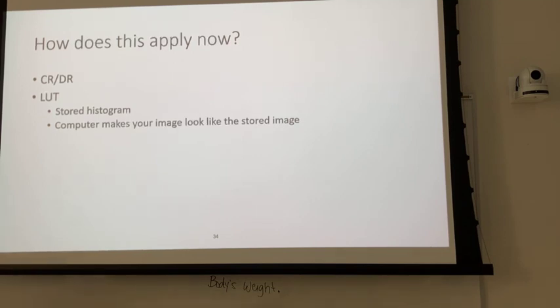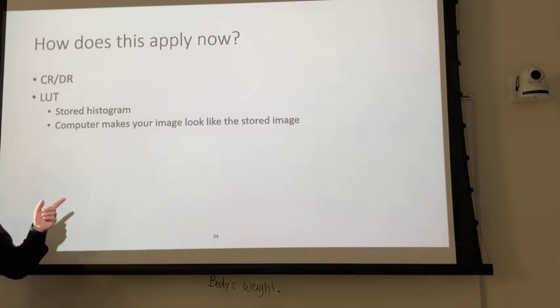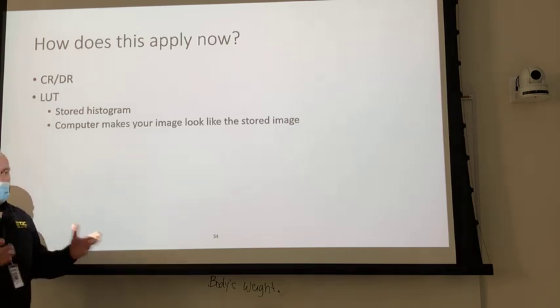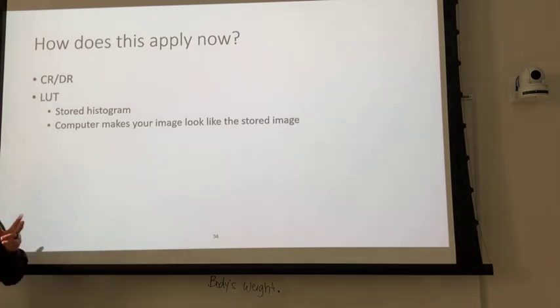Absolutely it is. It is absolutely a better system. It cut back on radiation exposure to the patient eventually. Whenever we talked about screen speeds before, whenever we went to CR, the dose went up to the patient, but once we went to DR, it went down dramatically in that respect. And then it also fixed the slight subtle differences in density and contrast that we might have had to do a repeat on before. So it's doubling of a reduction in exposure to the patient.